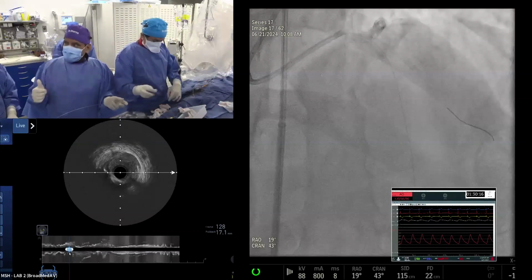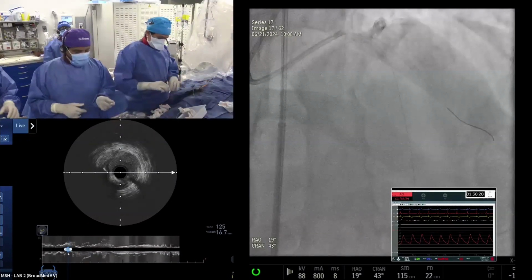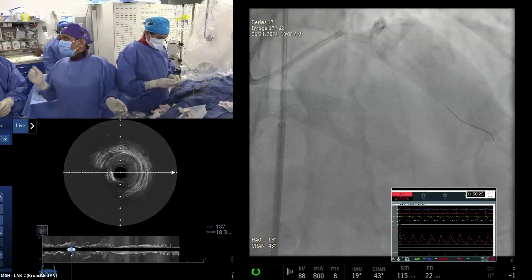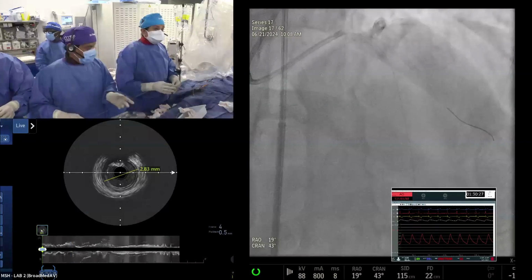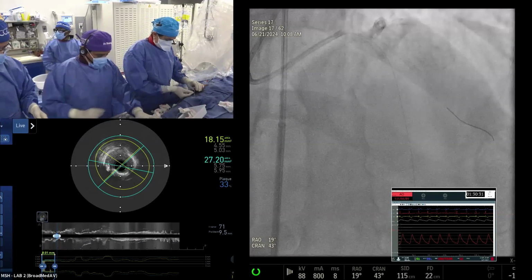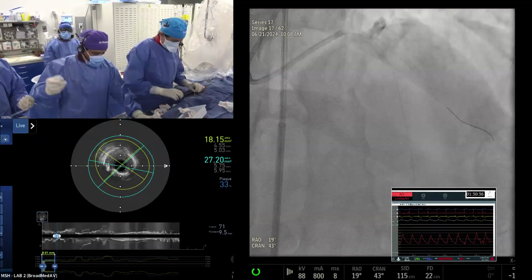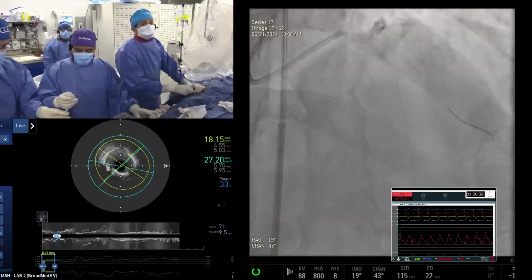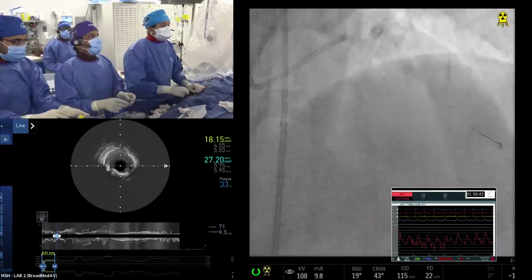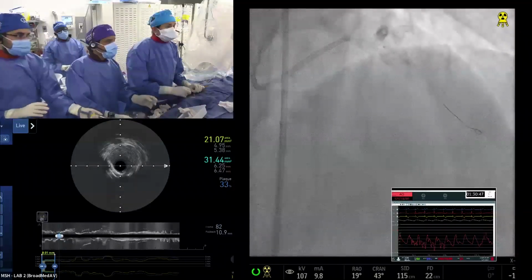Yeah, actually we have up to 30 and 40 millimeter length, but we have selected sizes we are carrying. So you're right. We are going to optimize the minimal MLD of the diagonal. Looks good actually. Okay, so we took the advice. We are going with the 3 by 12. A little high pressure in the proximal area, particularly where the tightest disease was. Okay, bring the agent balloon, so we can finish the case.